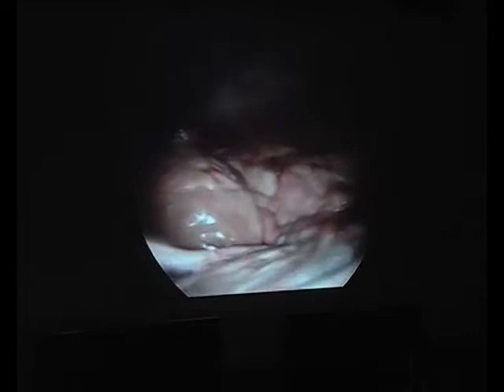But you can also see that it's very difficult to fix the abomasum if it's not displaced in this position. How to fix it here, how to bring in the toggle safe into the lumen of the abomasum. So I think it's important to bring in firstly gas into the abomasum and then bring in the toggle, yeah?